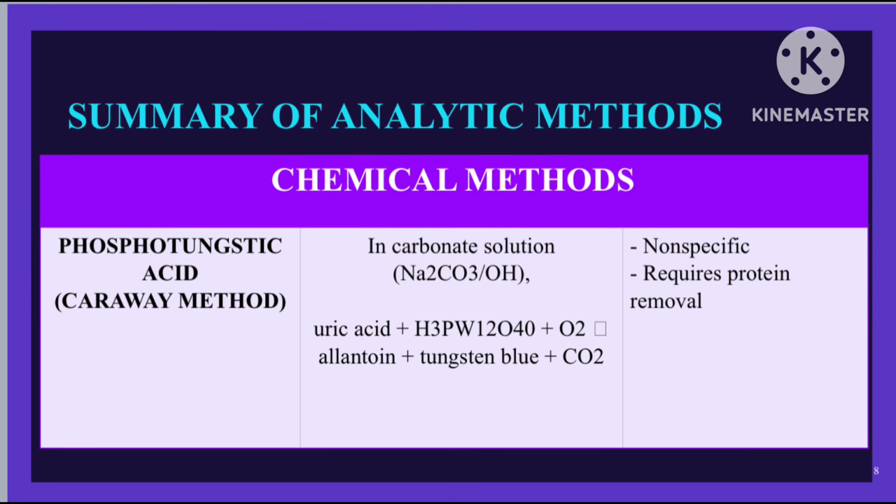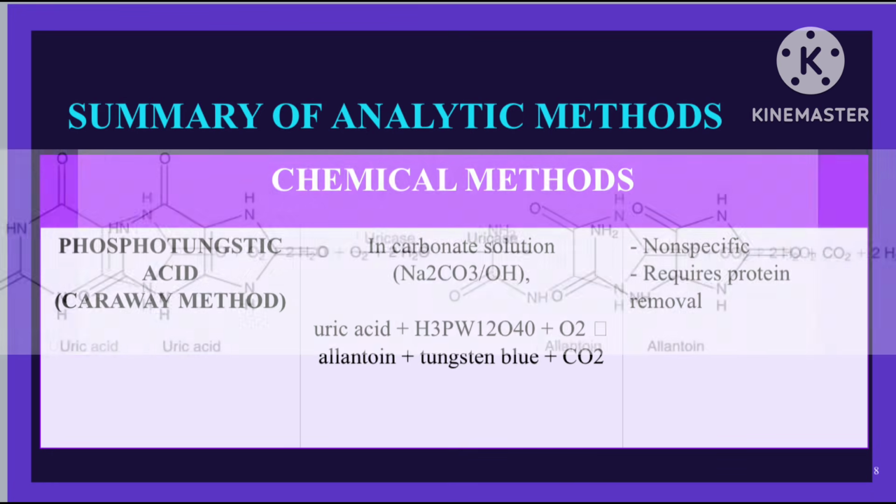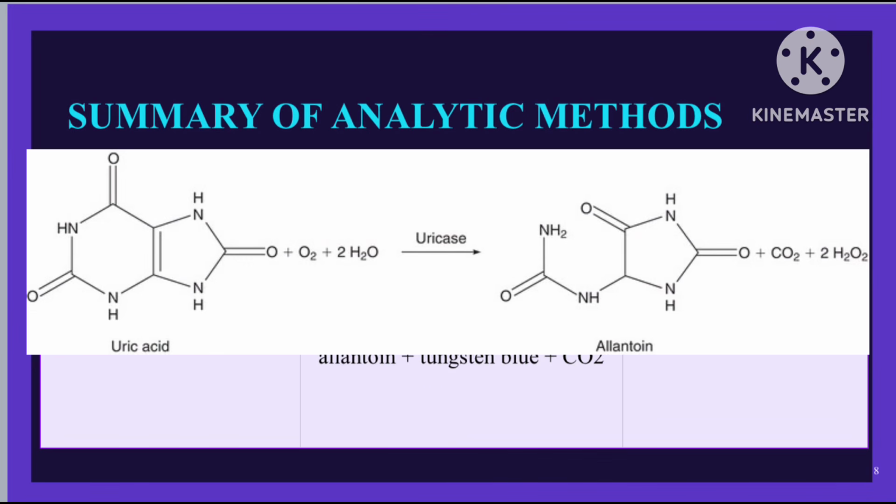And this reaction is shown in this figure that I am showing you right now. You can see there that uric acid is readily oxidized to allantoin and therefore can function as a reducing agent in chemical reactions. This property, class, was exploited in early analytic procedures for the determination of uric acid.